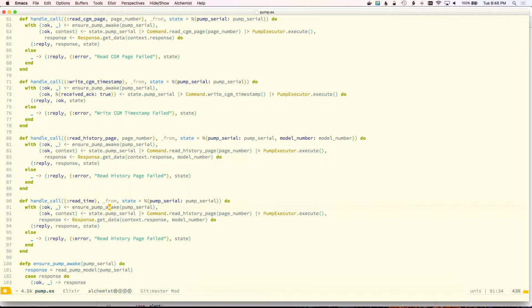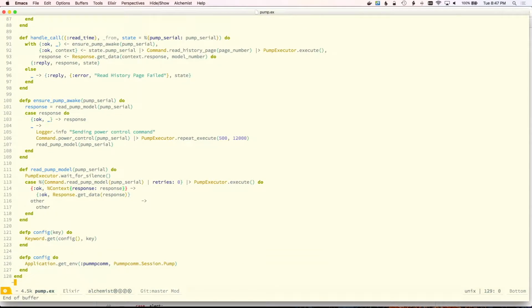So the first thing I do is ensure that the pump's awake, and that's just a command that goes and listens for other activity around the frequencies of the pump communication. If there's another pump or another loop talking right now, I don't want to step on their communication. So I both listen for some silence, and then I wait and then ask the pump that I'm really looking for whether it's awake. If it's not, I send this crazy blast of data to it to wake it up. And you can kind of see that here. It calls power control, and it repeatedly executes the same command 500 times, which is like, hey, wake up, hey, wake up, hey, wake up, hey. And then finally the pump just says, fine, whatever you want, I'll wake up. So it's kind of like getting my kids out of bed in the morning.